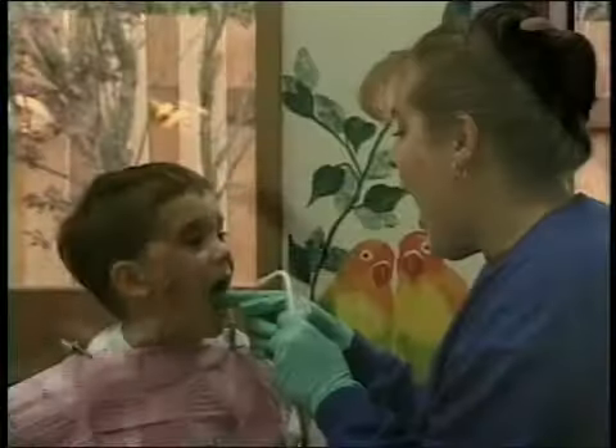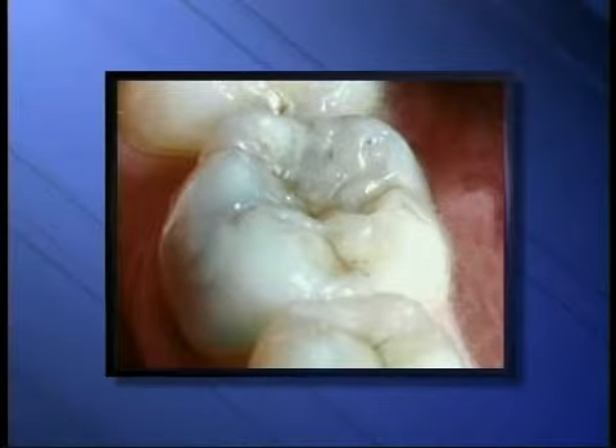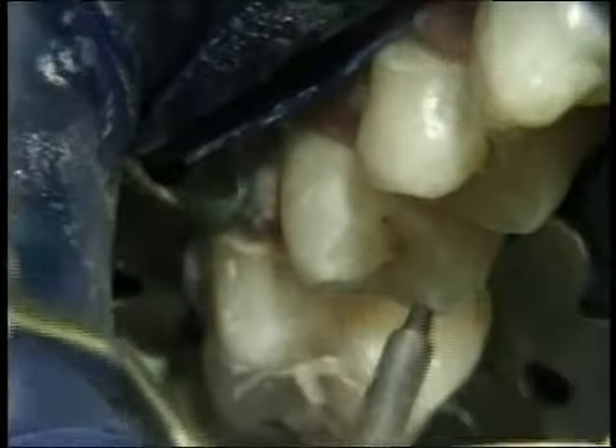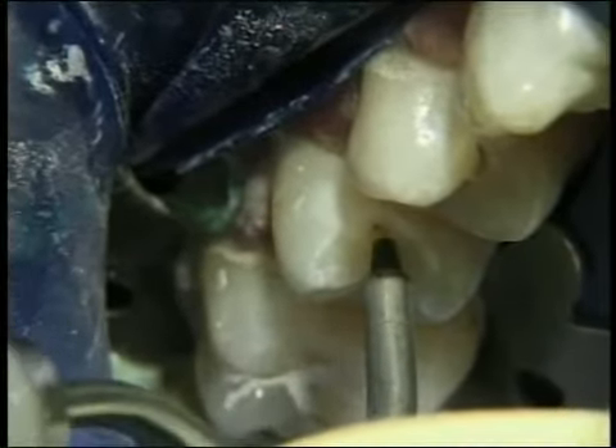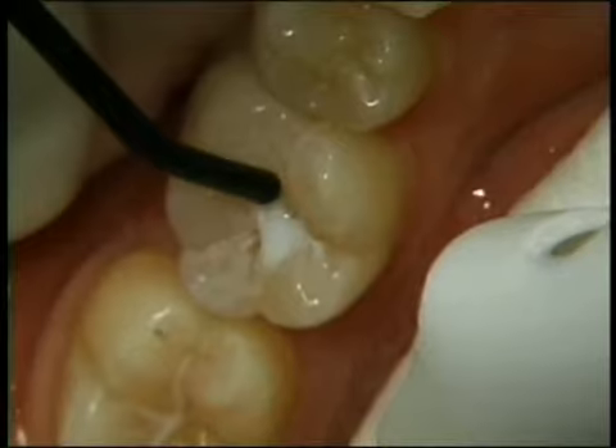Air abrasion is particularly useful in children to help diagnose and repair cavities on the biting surfaces of back teeth. As the stream of air and particles crosses the biting surfaces of back teeth, the stain within the enamel is removed and we can then place a sealant.